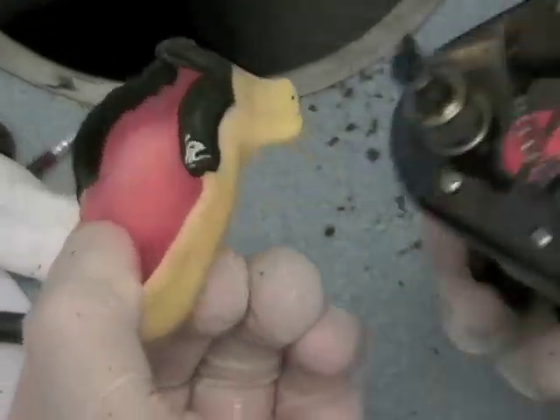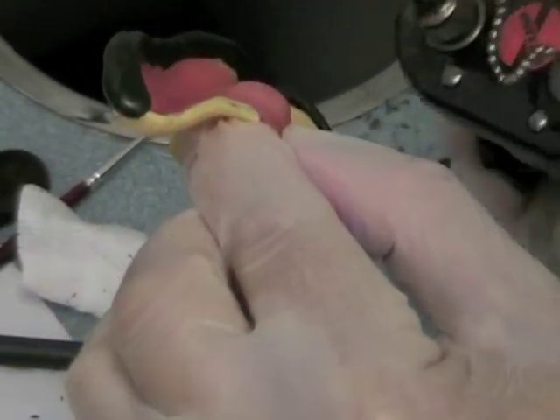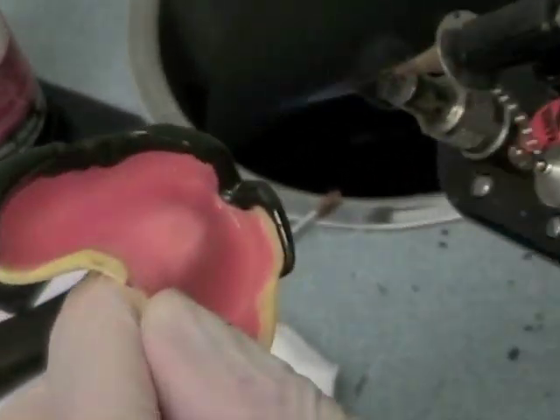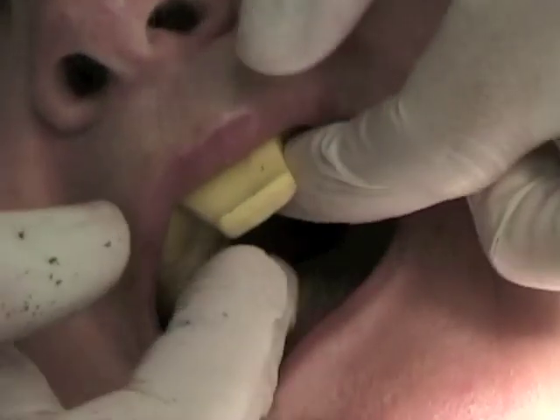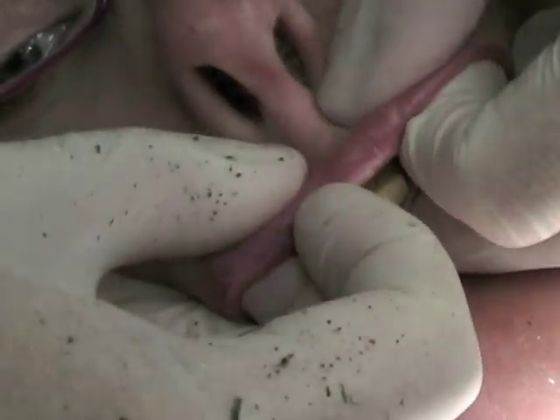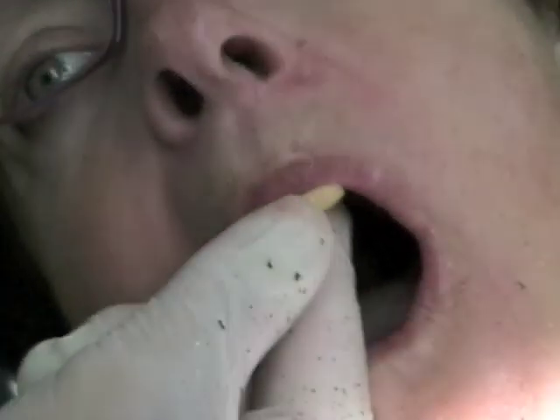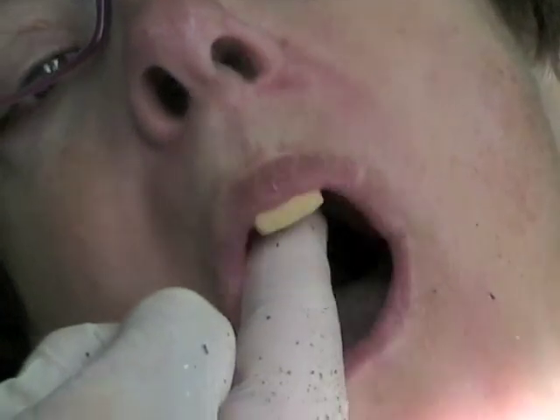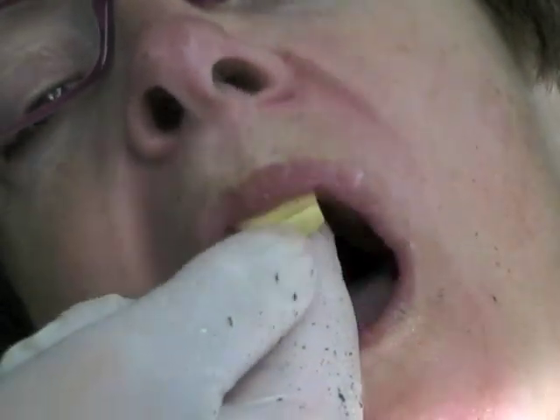In the area of the labial phrenum, make sure that the compound is very soft before you insert it. The labial phrenum is very displaceable and if there's any body left in the compound, it will actually displace the phrenum. Place the tray in the patient's mouth after tempering in the water bath. Pull downwards and outwards in a very pronounced fashion. Also have the patient make pursing and puckering motions with their lip to help mold the labial phrenum and make sure that it has enough relief.